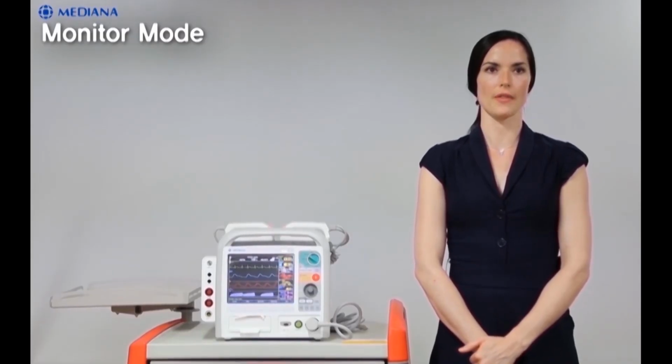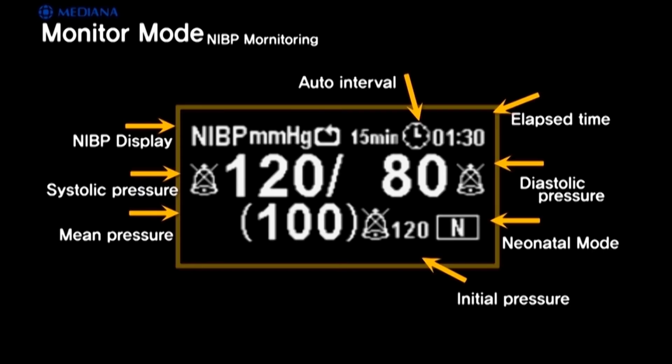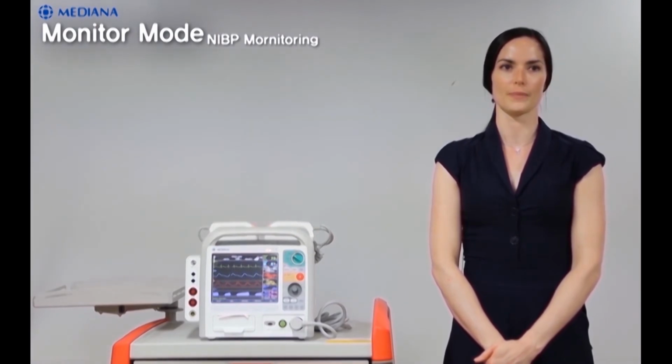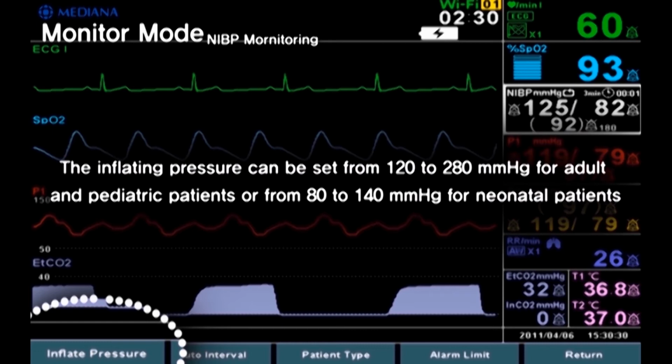Now let's continue with NIBP monitoring. Here you can see how to check the NIBP display measurements. Let's take a closer look at the NIBP menu. Number 1, Inflate Pressure. The inflating pressure can be set from 120 to 280 millimeters of mercury for adult and pediatric patients, or from 80 to 140 millimeters of mercury for neonatal patients.